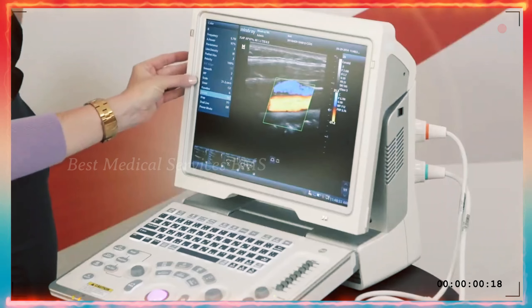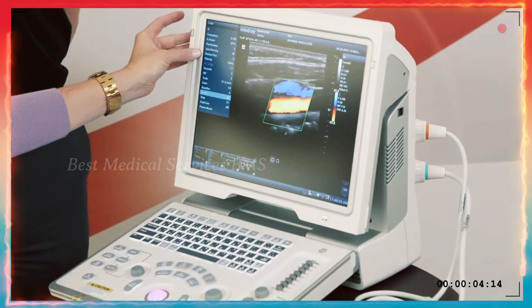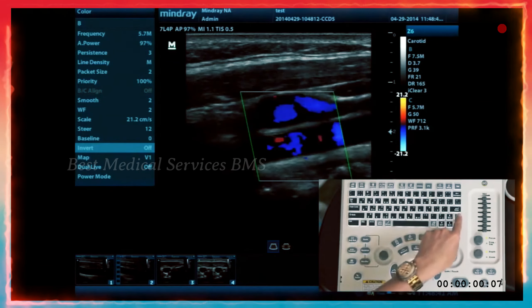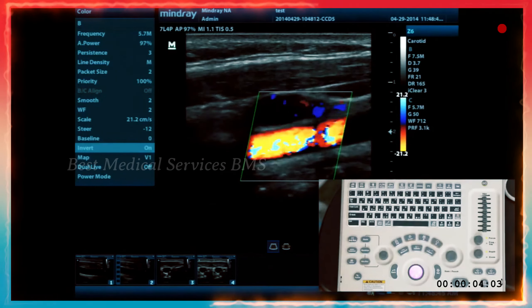Many of these parameters such as persistence, line density, and packets are things we don't normally change. But for invert and steer, there's a quick key to do it. Most of your image presets are going to be very good at honing in on the majority of what you're doing. If you want to change your scale, that quick key for scale allows you to press it and then use the rotary nav key to change the scale on the side of your screen.